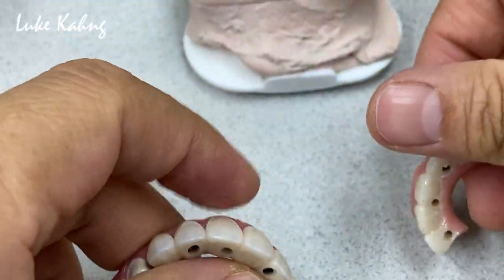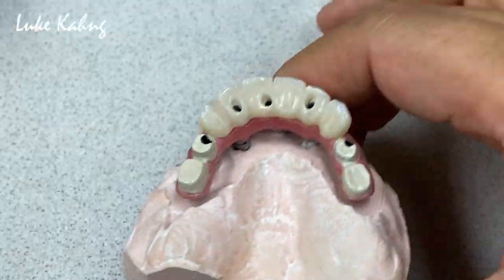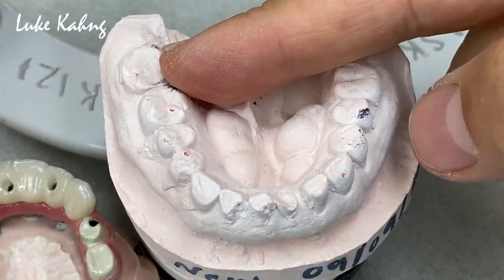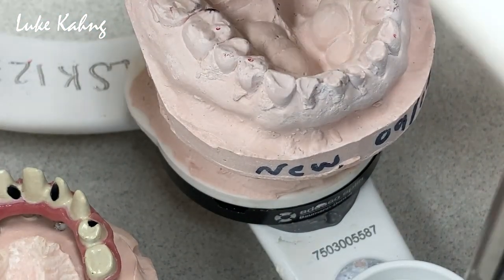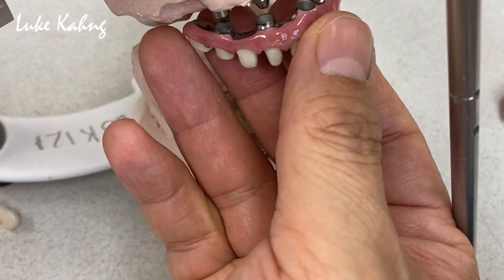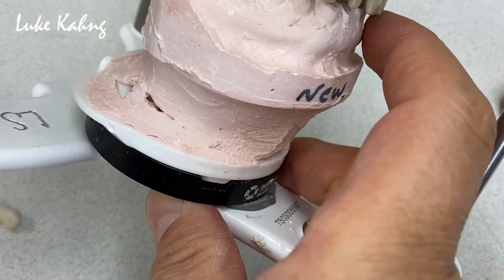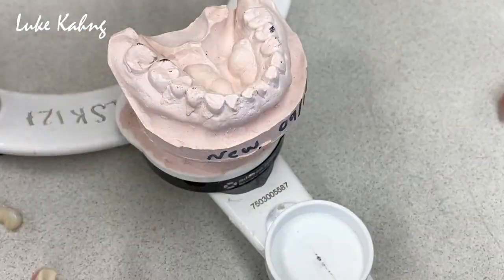This looks like a human made it, and the machine fabricated that. So the most problem is this. As you saw, this is all lowers grinding. So whenever they're biting, they're really tough. Which is the minimum vertical dimension, which we worried about before, right? So here is what it looks like. So we give them room as much as possible. Okay, then we finish it.